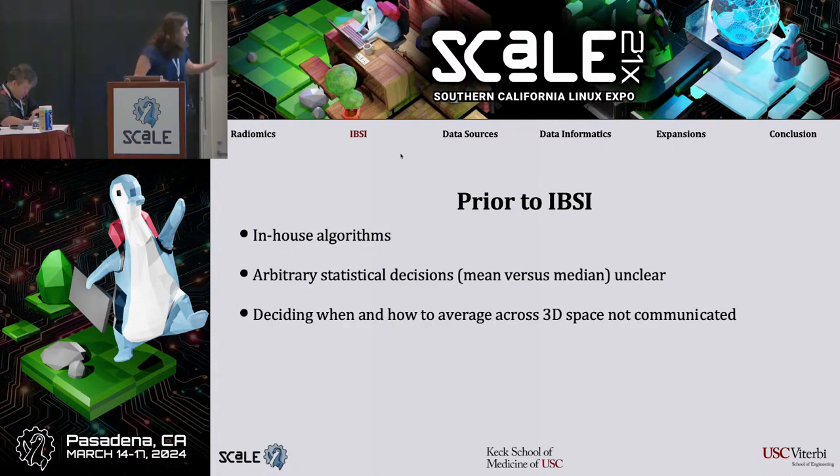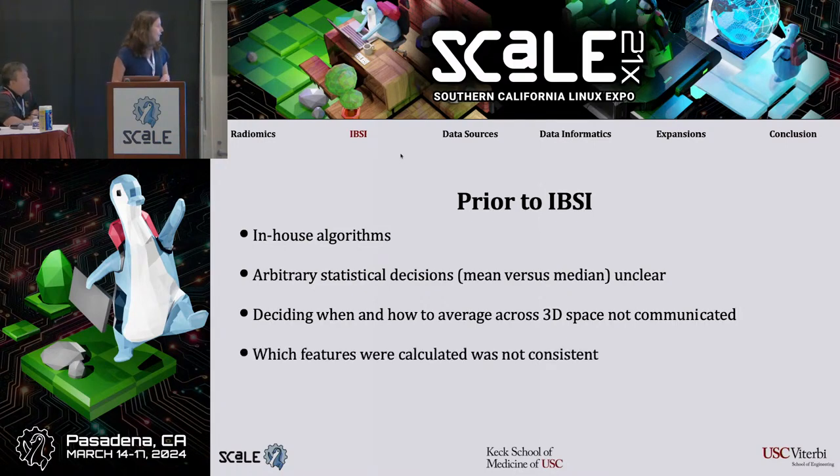And when we're looking at measures of central tendency, we can have the mean or the median, and technically they're both the middle, but deciding which one to use, while it may be arbitrary, becomes a difference that propagates when we're trying to compare across different centers. So when we choose different formulas and try and say it's the same thing, we're all speaking different languages, though we're all trying to levy math to analyze these medical scans.